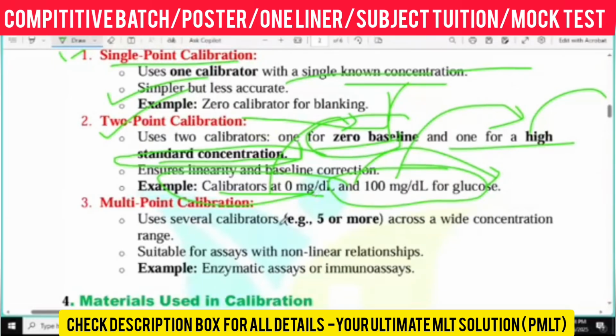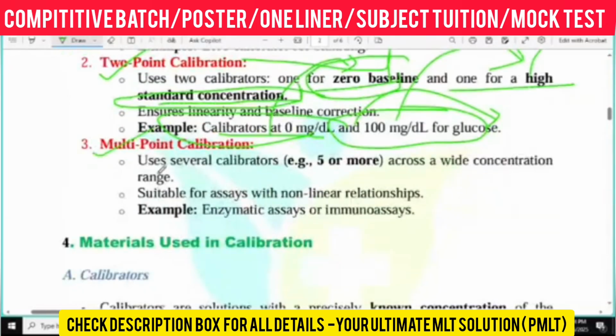After that, multi-point calibration basically uses several calibrators. Getting my point? Not only zero, but also other types of calibrator we are using here. It uses several calibrators, for example 5 or more. That might be 5 or more than 5, across the range of concentration, starting from zero and the concentration should increase. Getting my point? Suitable for assays with a non-linear relationship.